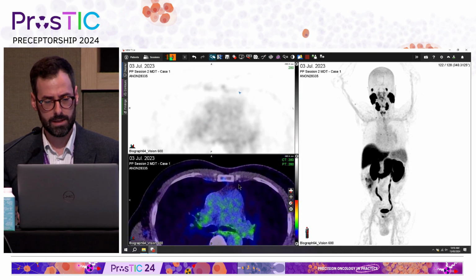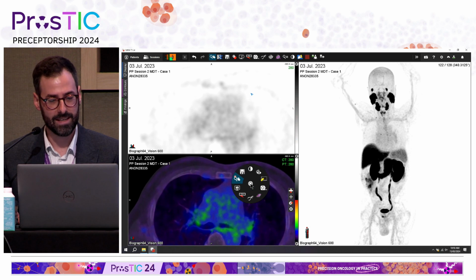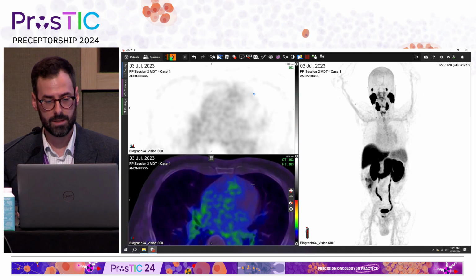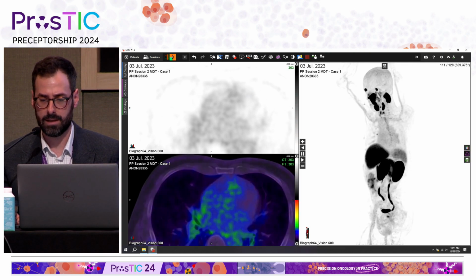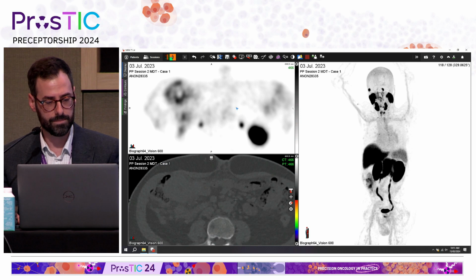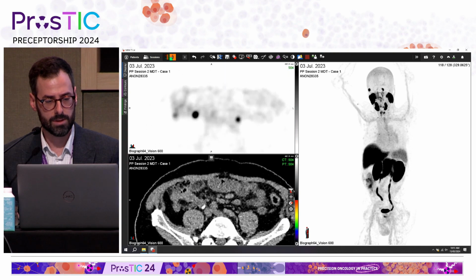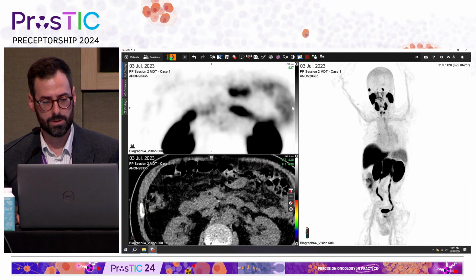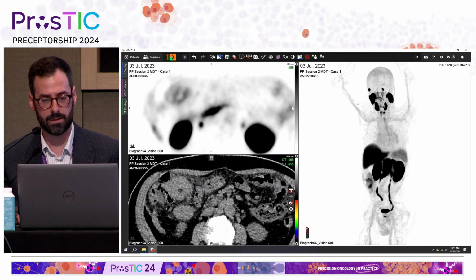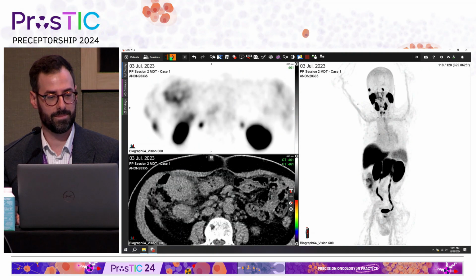And when you have a close look, you don't actually see any osteoblastic lesions underlying, just some little soft tissue abnormalities. And I think the most interesting thing is that there's this kind of tubular uptake in the right flank. When you have a closer look, there's actually this thickening of the distal bowel, which is quite prominent. Many little nodes as well, mesenteric nodes, a much larger one right over here, that don't have very much uptake, but raises suspicion. That wasn't a hint there, James.